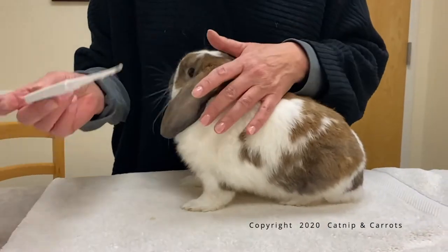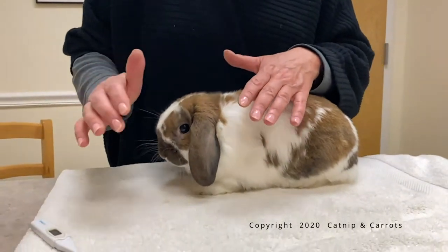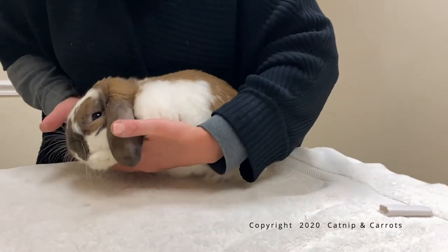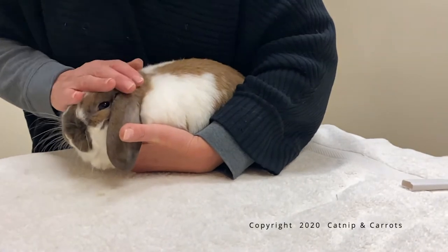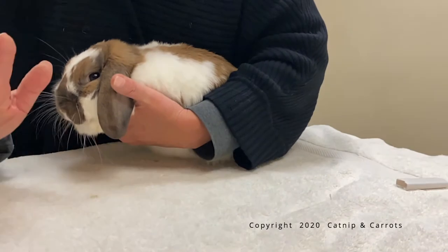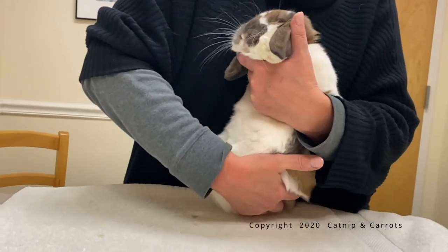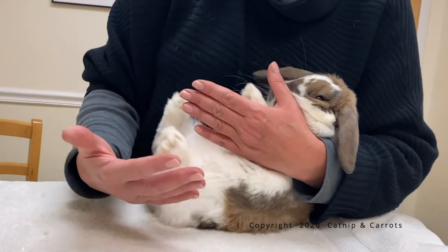The alternative way to do it is to lube up the thermometer first and turn it on first, then set it aside. I face the rabbit towards my dominant hand — because I'm a righty. I gather up his paws and his ribcage in both hands and transfer to my left hand. Now I'm pressing him against my belly, supporting him with my left hand, and with my right hand I'm reaching around the outside, cupping his bottom and gently curving him onto his back and resting him on the towel.